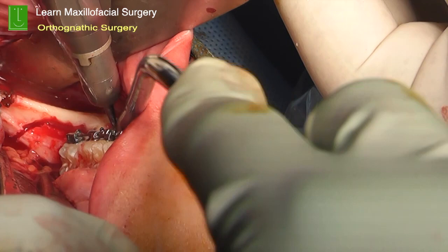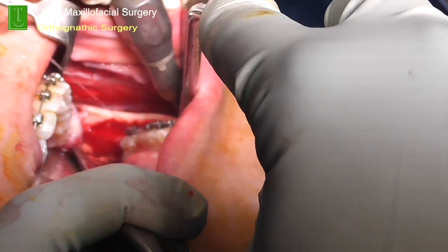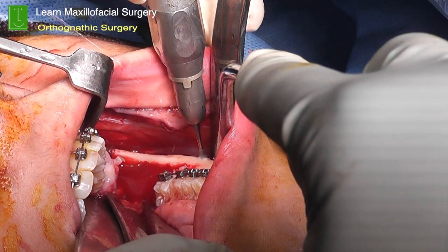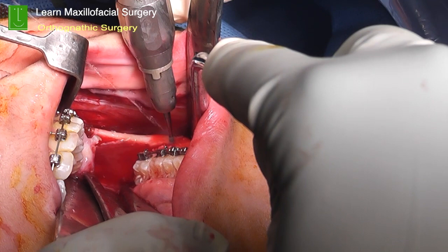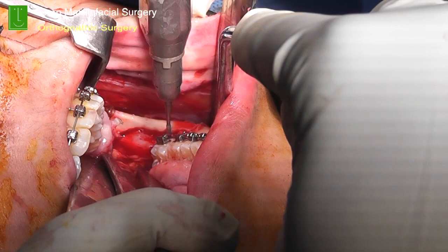So the lingual cut goes all the way to the lingula, and the buccal cut goes just where the bulge of the second molar is, going to the lower border of the mandible. So that's where we are retracting the soft tissues using a channel retractor or an Obwegeser retractor. It is a very, very nice retractor. It engages the lower border of the mandible, and it prevents the facial artery from being damaged. So this is very, very important, and that's what you're seeing there.